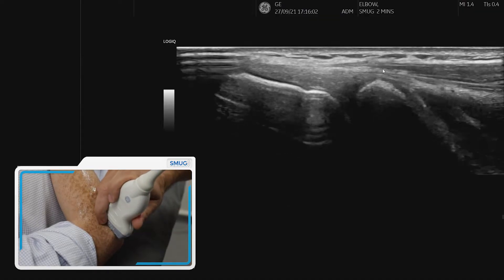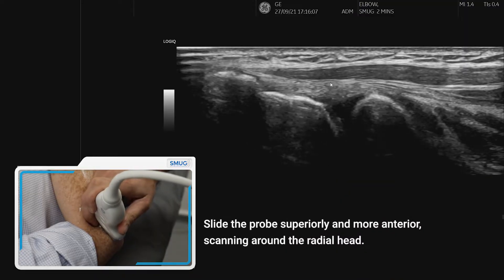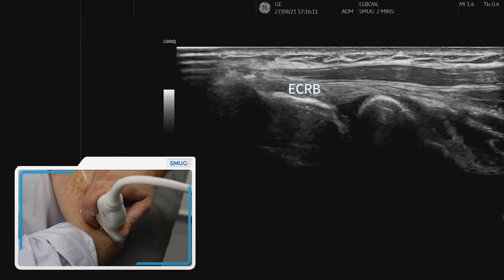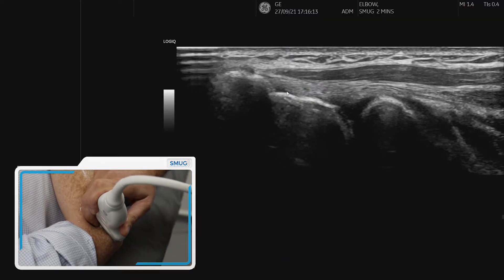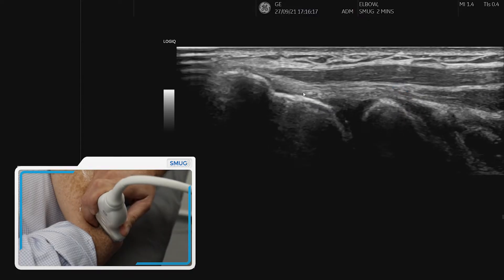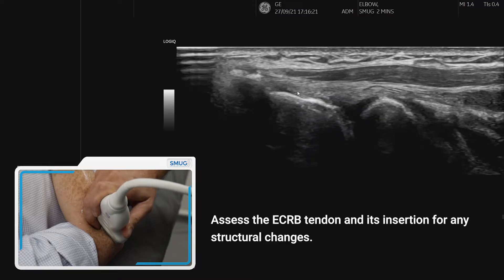To do that, we slide the probe up and angle back down. What we can see here is specifically the fibers of the ECRB attaching onto the bone. This is where we need to look carefully for any tendinopathic change, any neovascularization, and any tears.